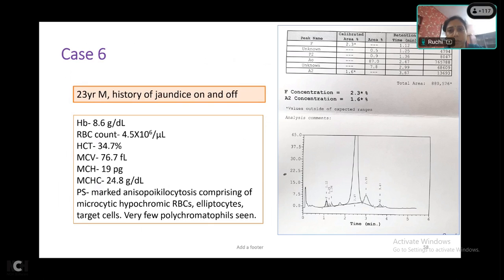Unfortunately we do not have the setup right now, so we do not do it. If it is an alpha thalassemia, we can have some fast moving bands in HB electrophoresis which will come after the adult hemoglobin. What else? Plus, it is a rule that when you say you have some variant hemoglobin, ideally you should show it by 2 tests. But now HPLC has become such an easy walkaway system that you supplement it by a parental screening. I would not say that parental screening is a replacement, but yes, it helps you to confirm your diagnosis.